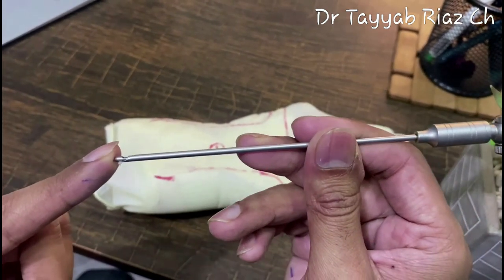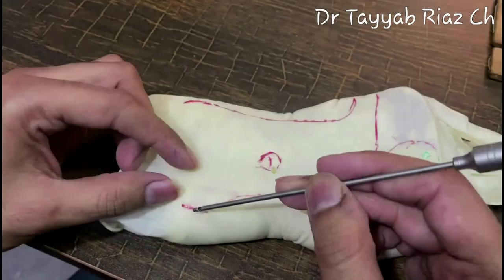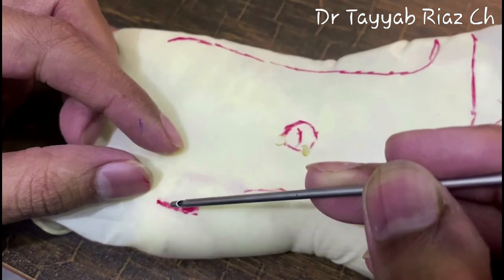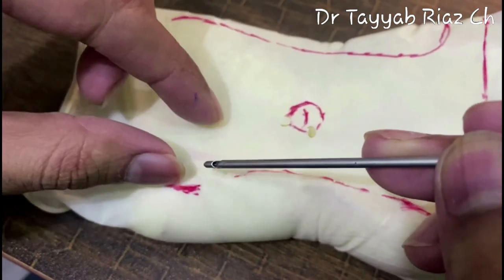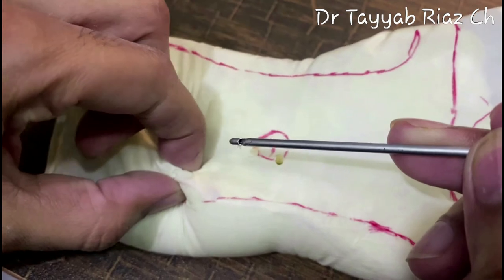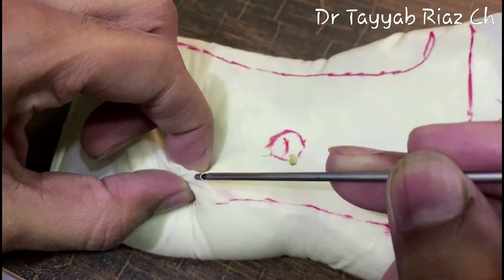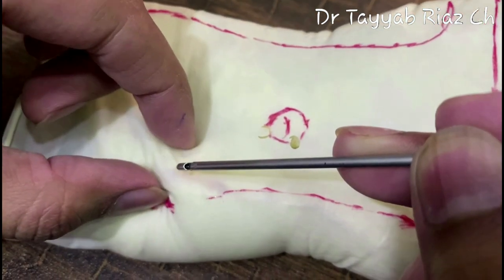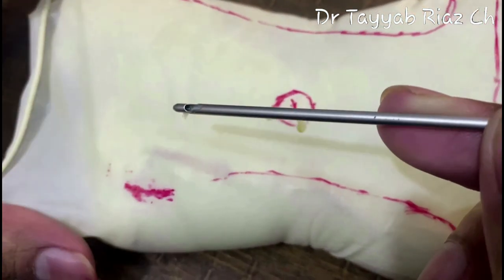For that you should measure the anterior abdominal wall fold thickness midway between the anterior superior iliac spine and the umbilicus, and grip this fold. The distance should be the thickness of the abdominal wall fold plus 4 cm. Why adding the 4 cm, I will tell you later on.